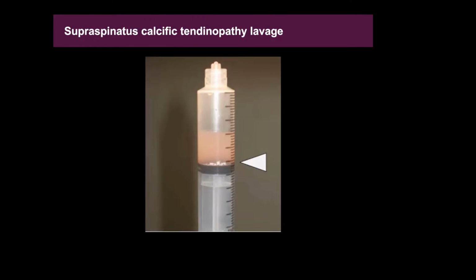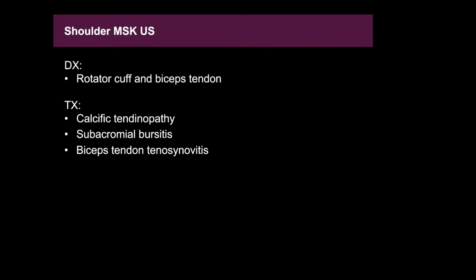And this is what your syringe could look like at the end of your procedure. You could see some dense calcification that kind of precipitates in your syringe. And that's something that you can offer your patients if they're really bothered by their focus of calcification.